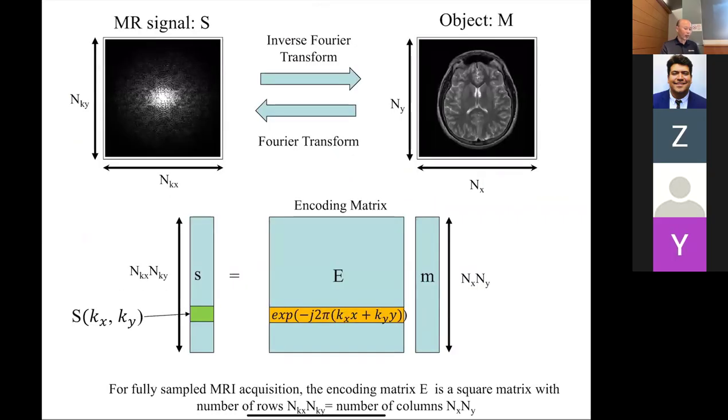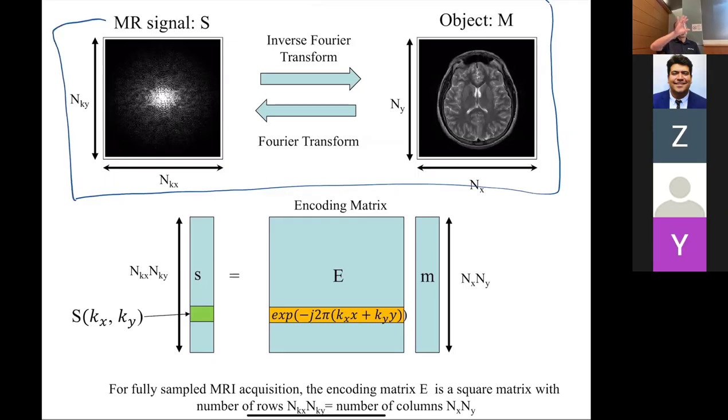Okay, just to remind you where you're at, and if you're still working on the homework assignment, just to remind you what we're trying to do, which is pretty much the first 4 lectures or so. We're talking about how you go from a Fourier transform back to the signal, and how you sample this Fourier transform sufficiently so your image looks good.